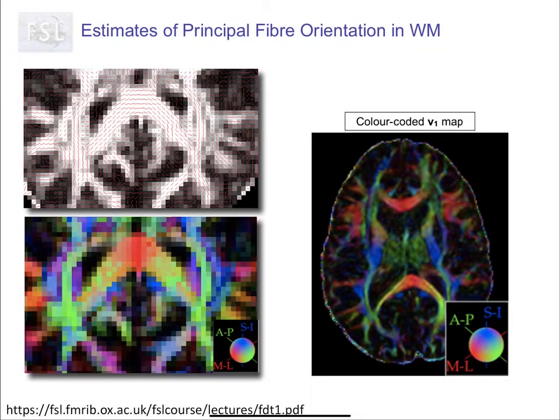So this is an example of that color map, and so you can see here, where it's clearly directions here. This is very green, okay. Left to right is very red here, but in between you see a mixing of colors where the voxels aren't purely X or Y. Okay, so this is what's called a color-coded orientation map. Right? So I mean, they're very pretty pictures at the very least. So you should definitely put that in your publication or in your thesis, right?